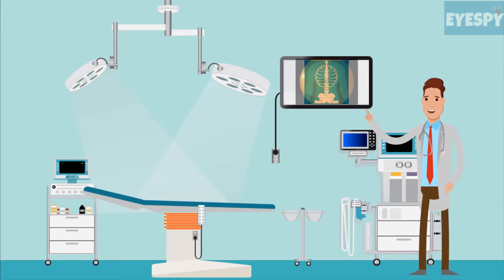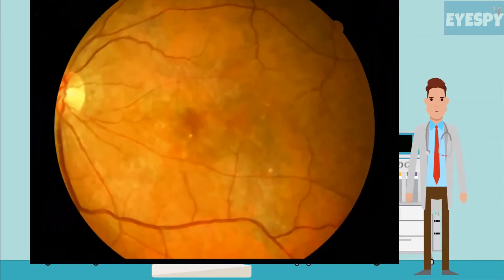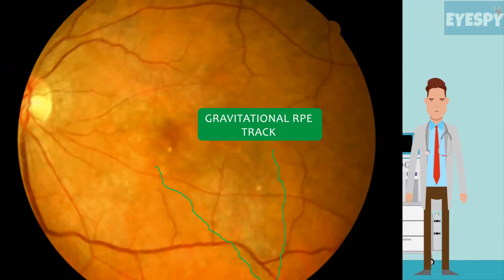Here is the fundus photograph of the patient. If you look carefully, there are diffuse pigmentary changes all over the macula. This is referred to as diffuse retinal pigment epitheliopathy. Also to be noted is an inferior RPE track, usually in a teardrop configuration due to gravitational tracking of subretinal fluid.